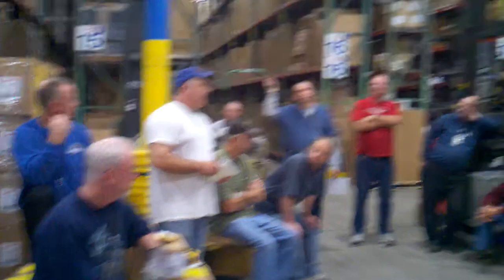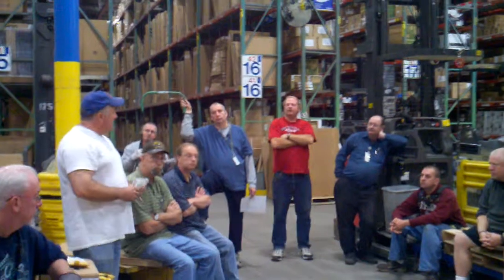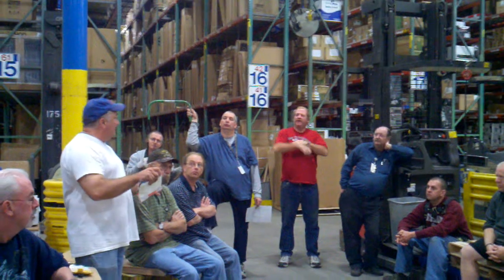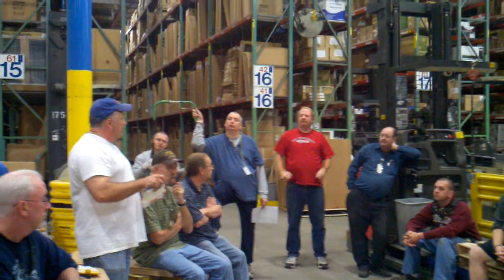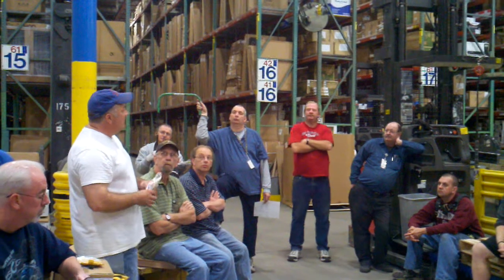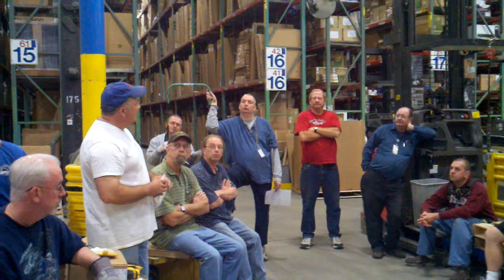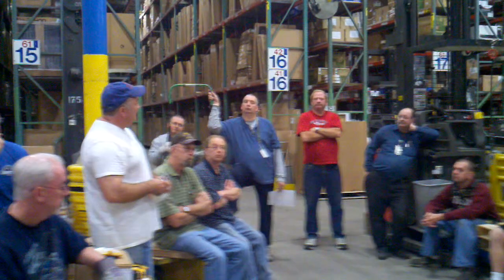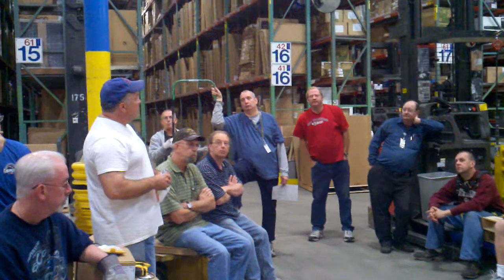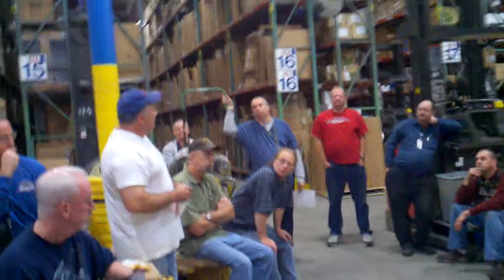As a rule of thumb, how much more powerful are the ones you use for ambulance? No, I think it's the same. Paramedics can do it too. They'll attempt to, but it's more or less going through the motions. It's got to be a rhythm that's shockable. I don't know if in a hospital setting they can do enough juice to shock a flatline.